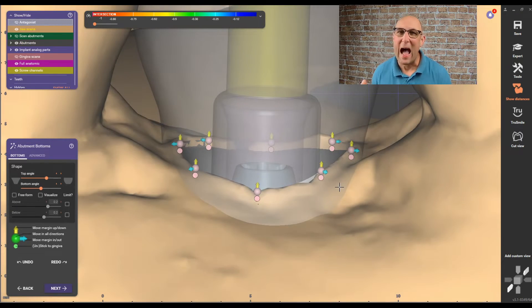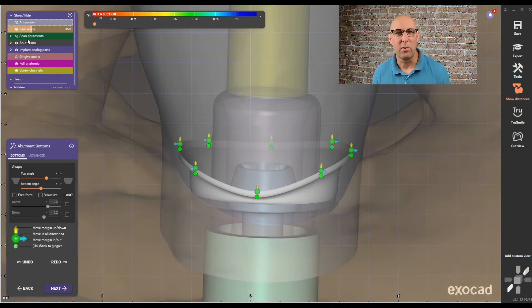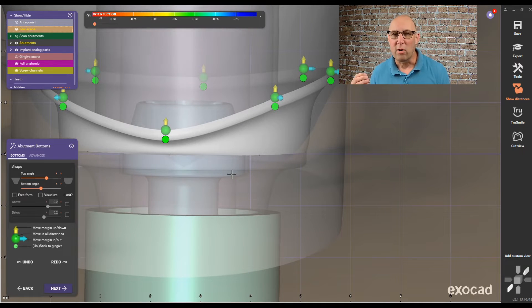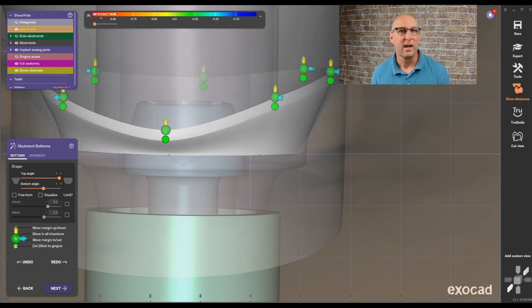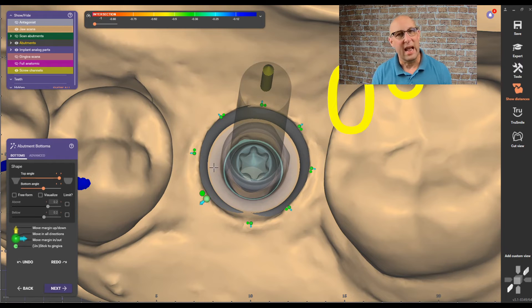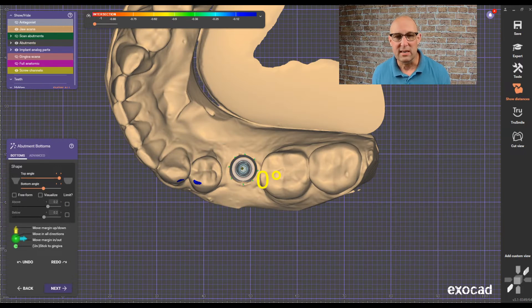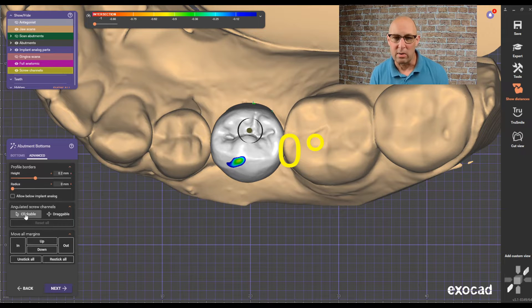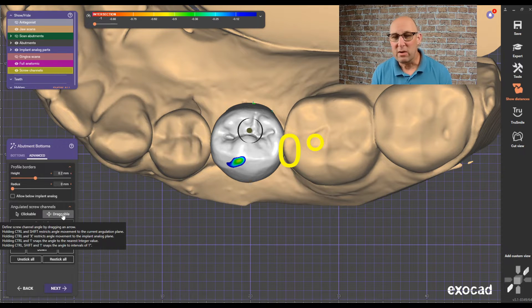When it comes to designing the emergence profile, I personally think that 3Shape did a much better job here. You can still change the top and bottom part. What you want to take care of is filling out the gap in the emergence profile with your crown — you don't want too much tissue pressure, and you don't want too little, which creates a gap where food can accumulate. Play with the sliders. The most important part is in the advanced mode, where you can choose clickable or draggable.